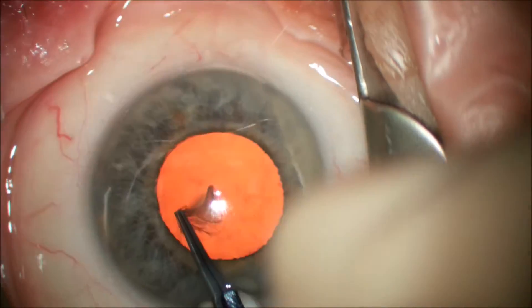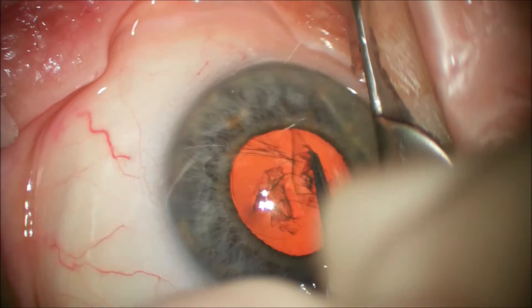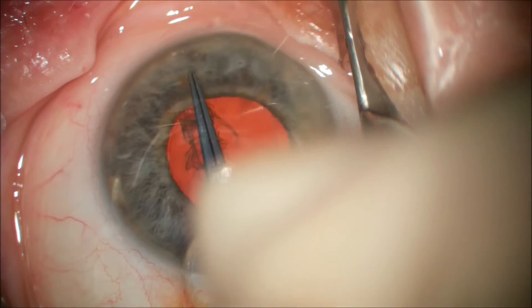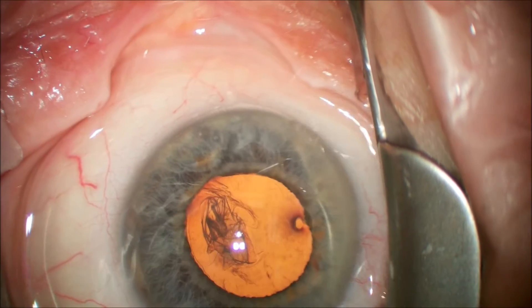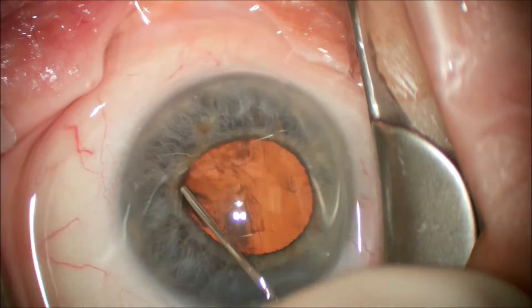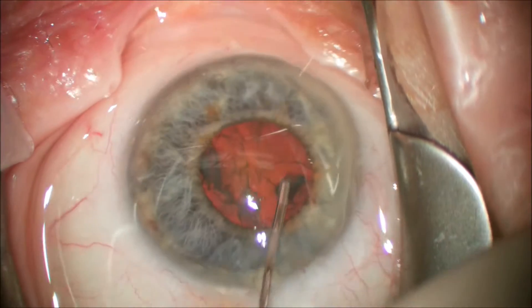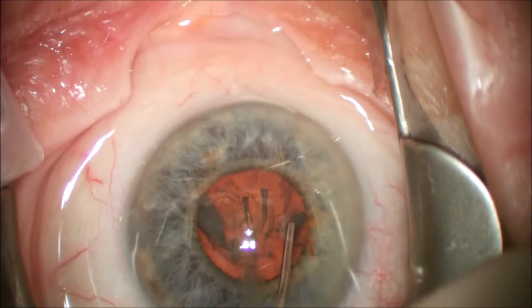We proceed by performing a capsulorhexis approximately 5 to 6 millimeters, and you can see that we go underneath the iris edge with the capsulotomy in a controlled fashion to get a capsulorhexis that is larger than the iris diameter. We then proceed with hydrodissection using BSS on a 27 gauge needle and we make sure that we can rotate the nucleus in the capsular bag.